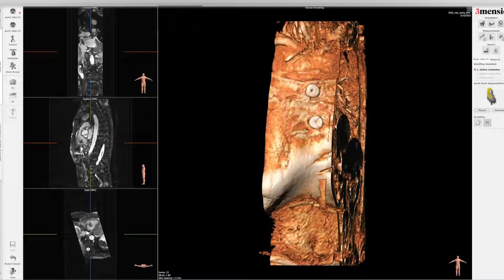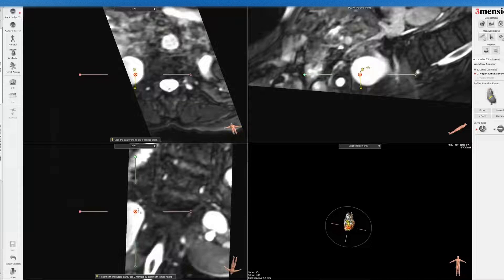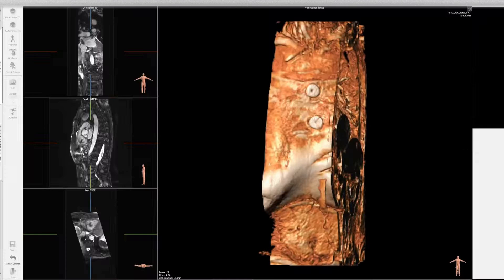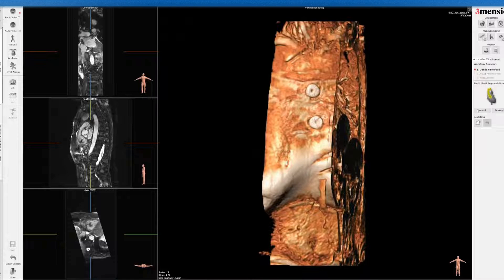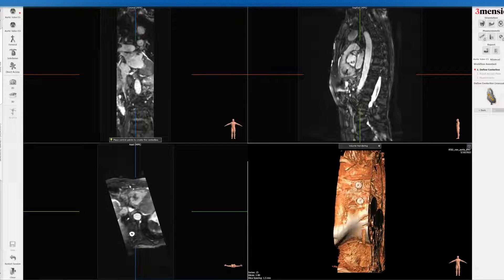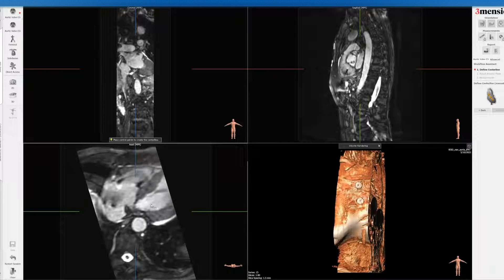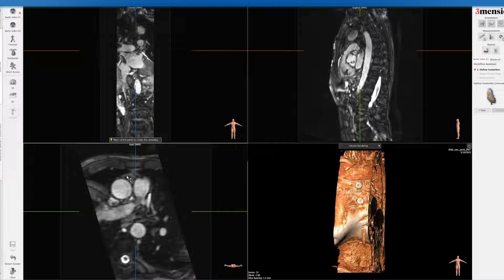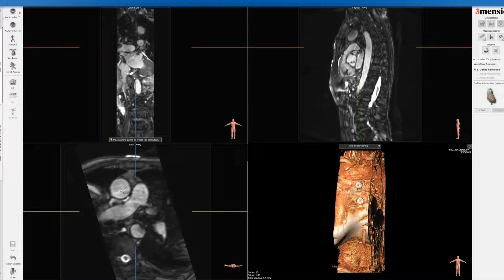You can see that here I cannot do automatic segmentation because it would be inaccurate — it did not give you the correct segmentation. So rather than doing that, you would go back and do a manual segmentation. When you do manual segmentation, you can see this is the heart — this is the left ventricle coming out to the aortic root. What you need to do is segment the aortic root manually.